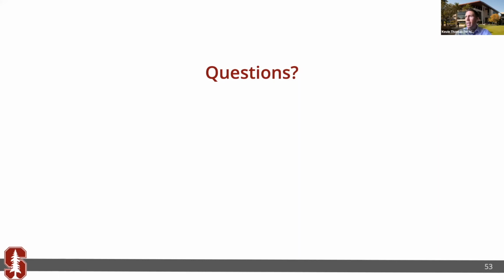So one example of that is if one of your transforms is processing all of your pixels so that they're between the value of 0 and 1, then it's very important that during test time, you also process all new images so that the pixel values are between 0 and 1. And you need to do that processing in the exact same way you did it in training, because that's how the model learned to generate its predictions. And if you change the distribution of the data, it's going to start to have problems.